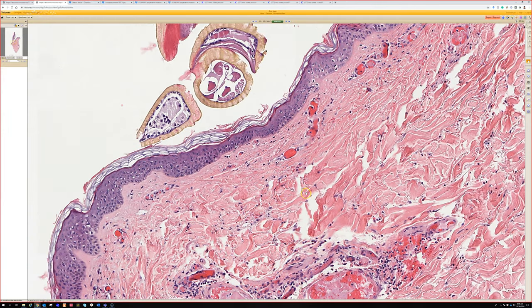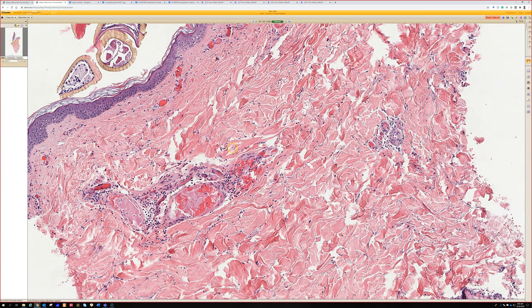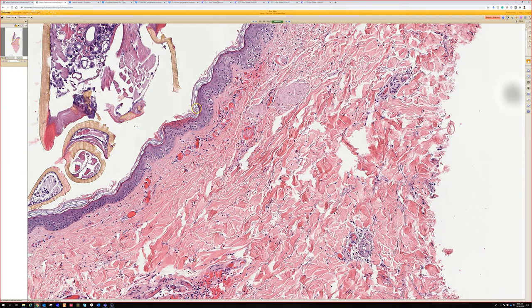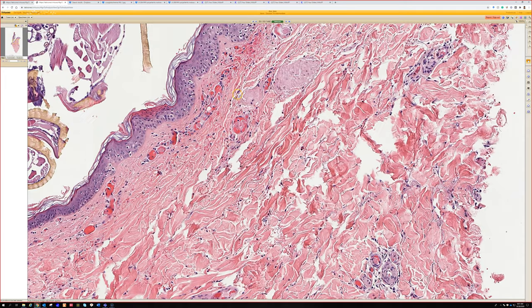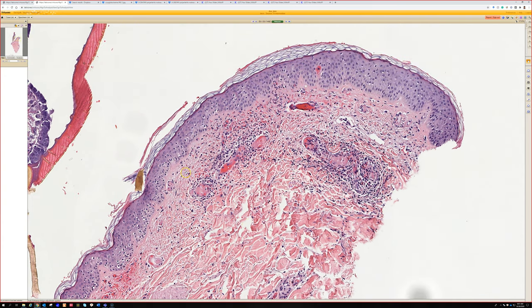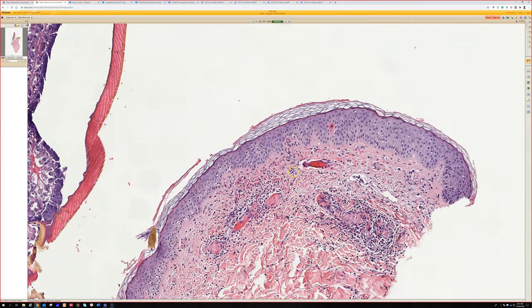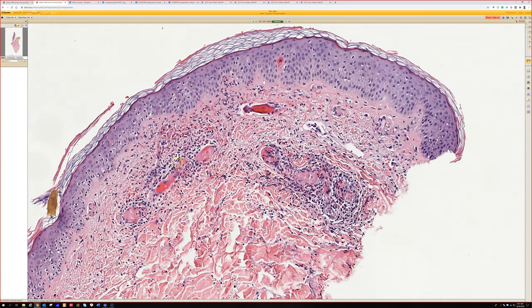Here's the tick mouth part. A lot of times what we see on a punch of retained tick mouth parts — we see arthropod bite reaction changes and just a little fragment or cross section of one of these embedded in the dermis. Anytime I see this yellow chitin stuff in the dermis, that's probably a tick mouth part. You can sometimes see leukocytoclastic vasculitis and fibrin thrombi in association with arthropod bites and tick bites, also with scabies. Scabies can have fibrin thrombi in the setting of scabies — we wrote a paper about that actually.